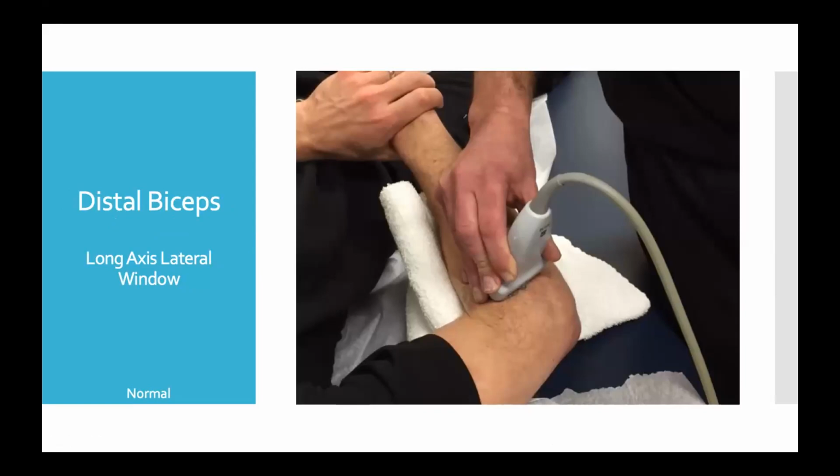We did not do it for this patient specifically, but I wanted to include these in the talk today. There are some other windows that we can evaluate the distal biceps tendon, and they aren't the best for seeing the details of the insertion point, but they are both dynamic examinations that, if you're having trouble discerning a complete versus incomplete or partial tear, can give some additional information.